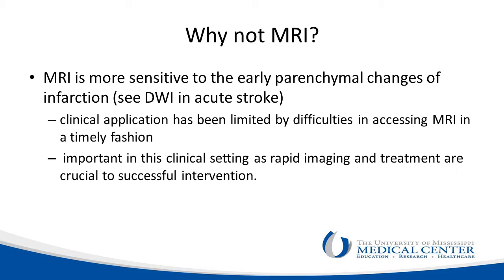So why not do an MRI? The MRI is going to be more sensitive in the early parenchymal changes of infarct. However, it takes a little bit longer to get an MRI, and also the MRI is not necessarily going to tell you about the penumbra.